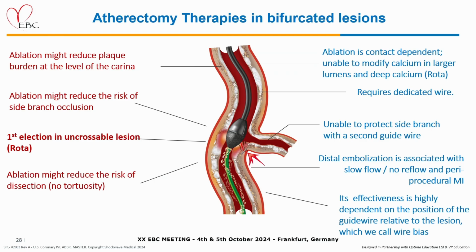But on the other hand, I think ablation needs a contact, so the bias of the wire is important. Also, it needs a dedicated wire, and it's not possible to protect the side branch with another wire, and also sometimes there is a risk of distal embolization.